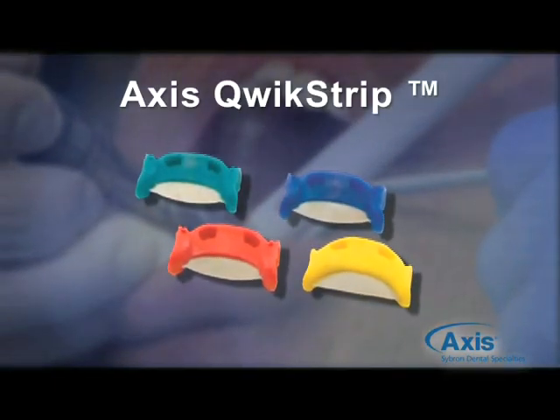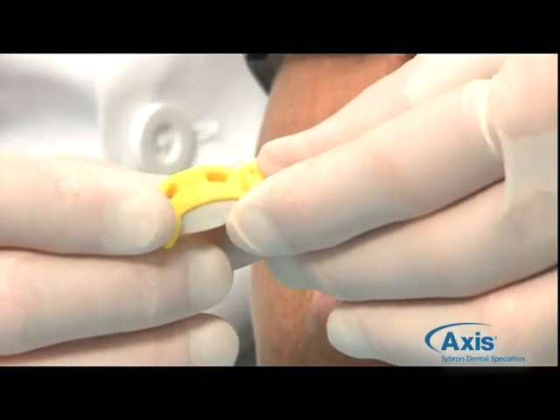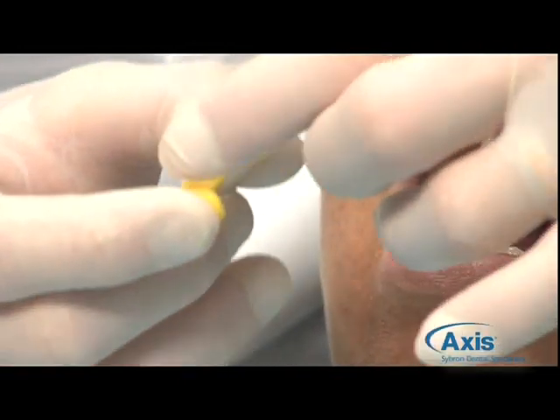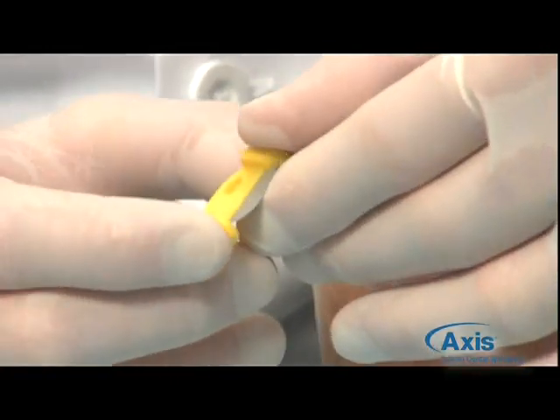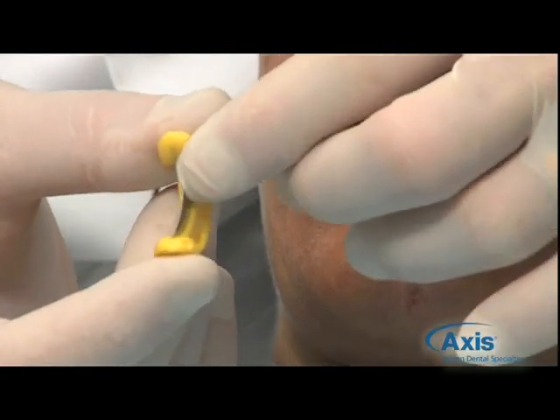Finally, I'm now going to go to my Axis Quick Strip. The Axis Quick Strip has a lot of nice little features to it. One is it's got these really great little grips to hold on to, and two, it's got a semi-lunar shape. It also has abrasive material only on one side, so that you can actually safe contour a tooth.